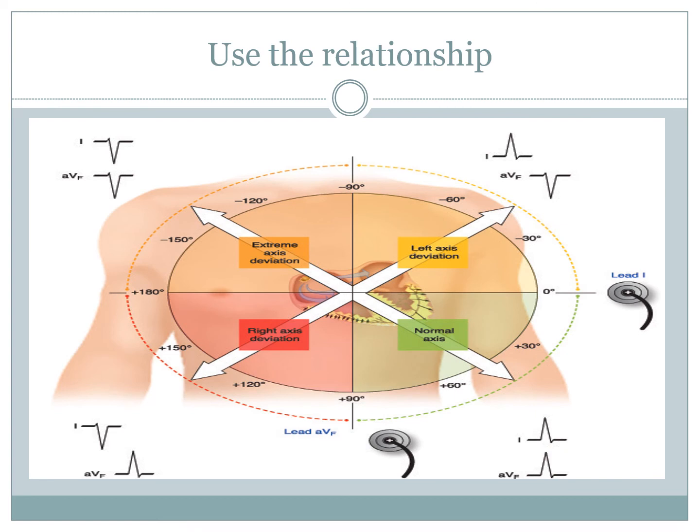When you're looking at a 12 lead ECG, always start by looking at lead 1. If lead 1 is positive, you will know you are going to have a normal or left axis deviation, because it's on the right hand side of the circle the way you're looking at it. Negative 90 to positive 90.